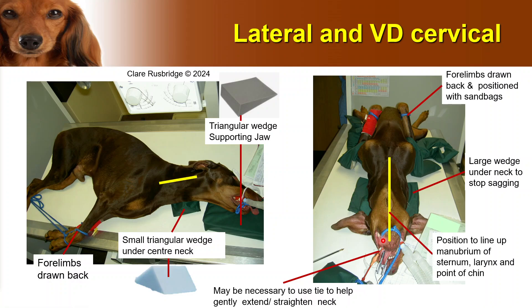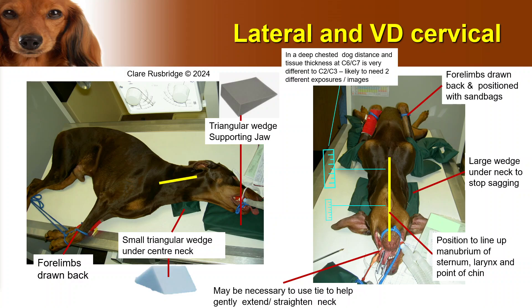I need to line up the sternum, larynx, and point of the chin to make sure this is completely straight. When doing collimation, bear in mind that in a deep-chested dog — especially when you take into account that you need to put a wedge under the neck to stop it sagging — the distance at the cranial end is a lot greater than the distance at the caudal cervical region. It's very unlikely you're going to get one exposure that is perfect for both. So make two images: one optimizing the exposure for the cranial region and one for the caudal cervical region. Don't forget to put something under the neck to make sure it's not sagging, otherwise those vertebrae will be artificially close together.